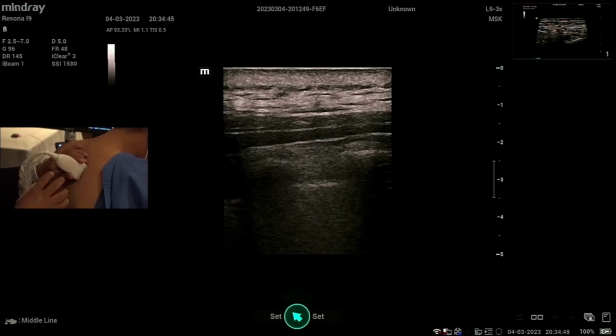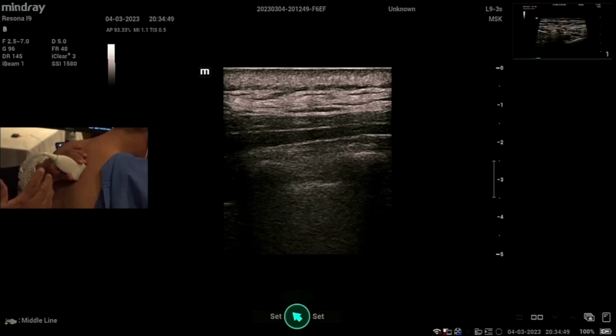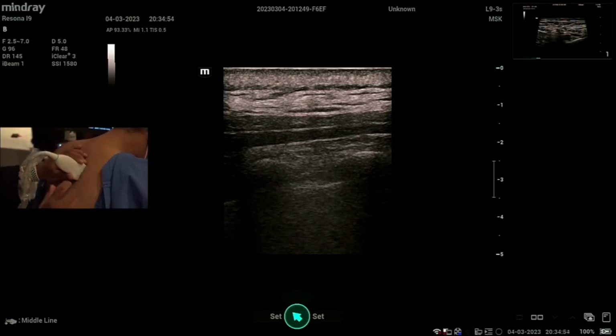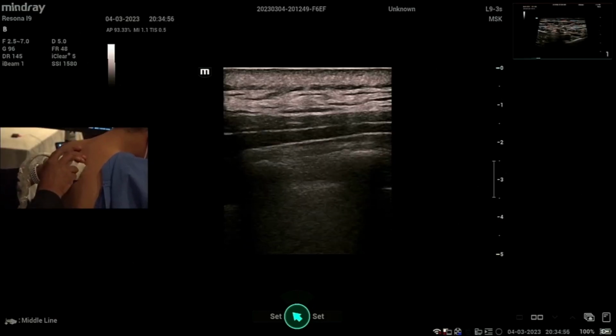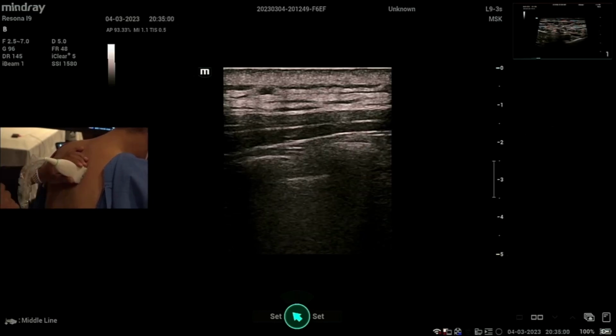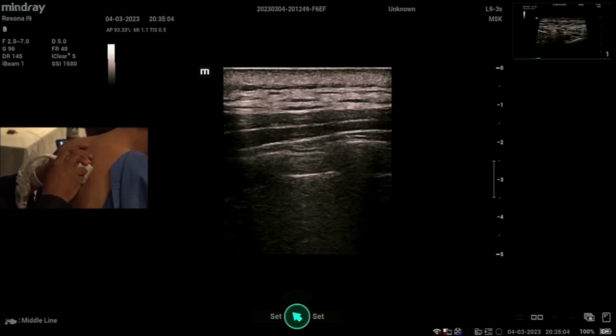Okay. So you see, these are broadband transducers. Each transducer is optimized for high, mid, and low range, depending on the bandwidth that it offers you. So you can see now that the image has already become a lot better, right? Because we've made some changes here. Can you tell me what the dynamic range is here?